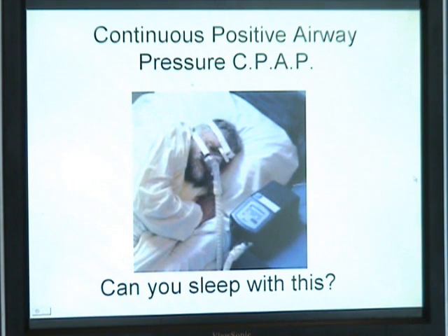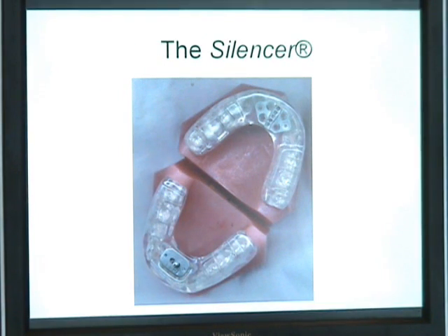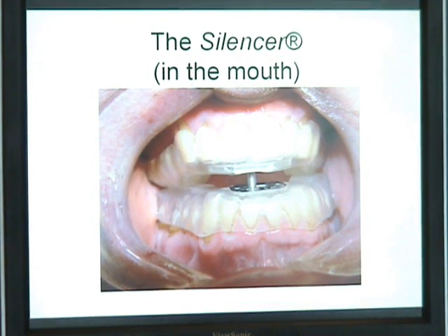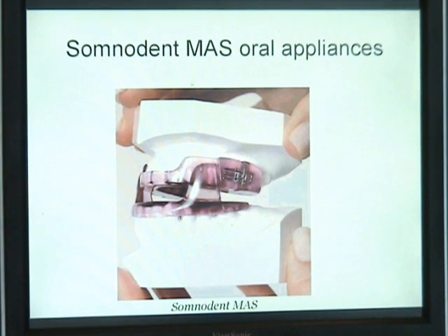Okay, we started from the most used to go to the least used of these devices on the market. And this one has straps on the side that actually stretch, and then there's ones that don't move at all, and that's like this one here with the stylist, and it has little adjustment places on there to get it more forward to see how much you can handle. And then here it is in the mouth, and then here's another device with a screw in the front to pull you more forward, but no side to side or front and back, just like this one with a little expansion screw there. That's pretty incredible.